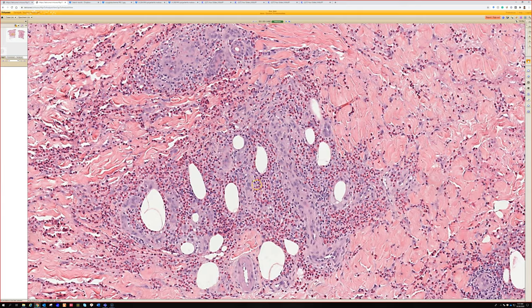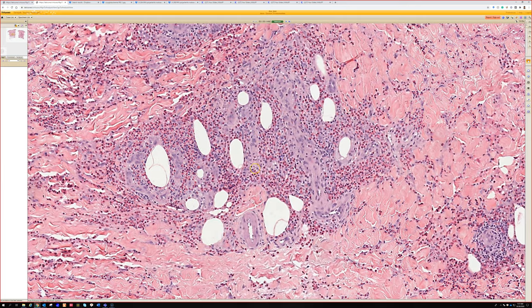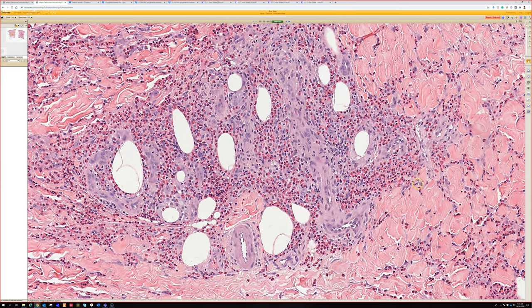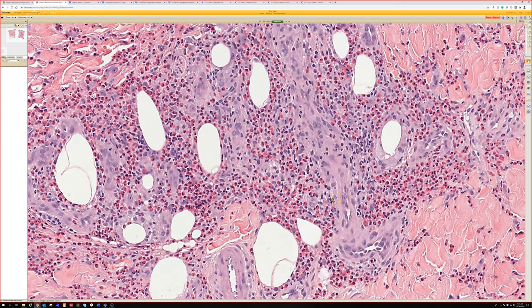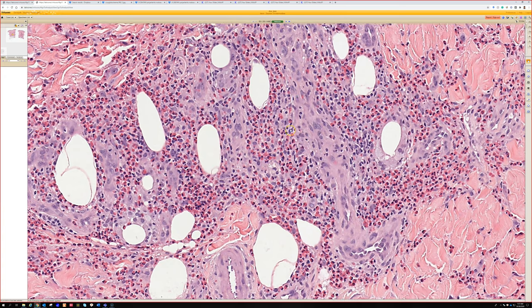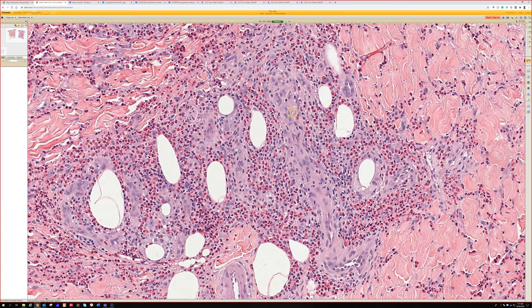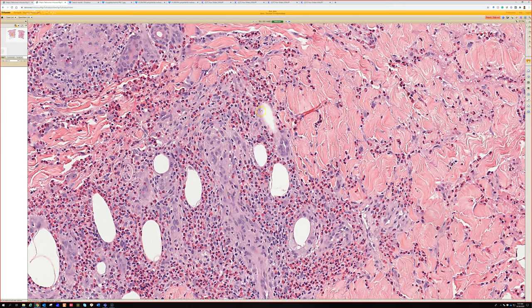When you look at the infiltrate, there are numerous eosinophils — eosinophils everywhere. See this vessel — you don't see obvious vasculitis here, but it does not look like a happy vessel. It's swollen. The endothelial cells are bulging into the lumen so much that you can't even see the lumen. That to me is evidence that there's some sort of vascular irritation or damage.